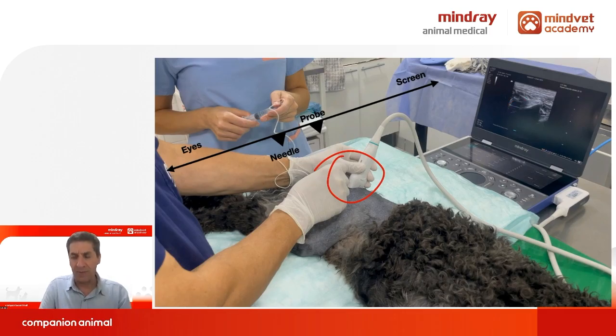This is dorsal. This is ventral. And my question is, where is this cardinal point? Do you remember our guideline? This can be lateral or medial. Should be lateral. So the marker of the probe is pointed laterally because we are scanning the dorsal aspect of the region.